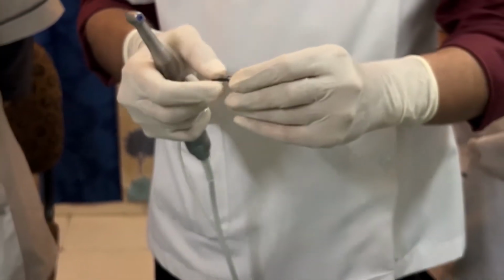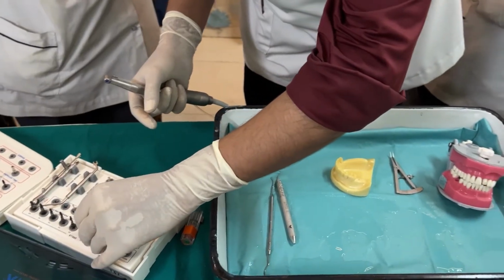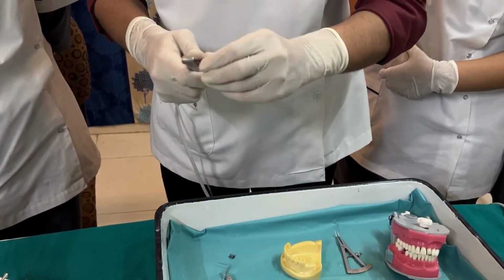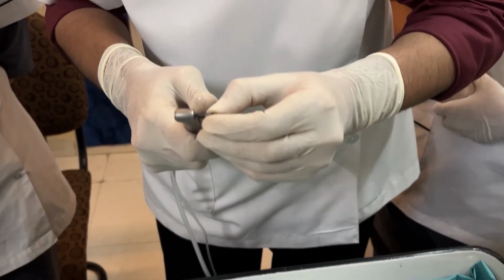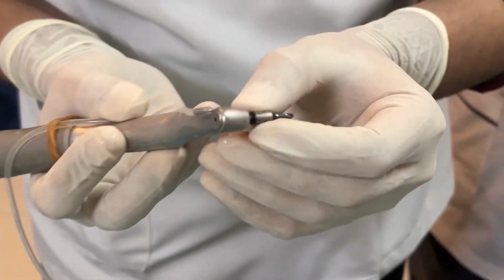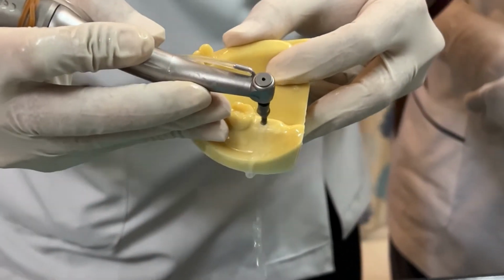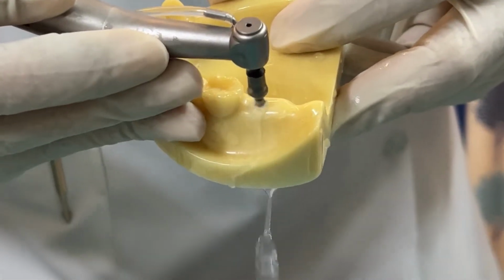So the next thing would be, I remove the drill stopper from the drill and start with the next drill. Next drill is 2.4. So 2.4 osteotomy, again the same thing. Now I attach the drill stopper. Once I attach the drill stopper, how much is the remaining length? Roughly a little over 11.5. So once I have confirmed, now again I will be starting with the osteotomy, and we take it out.